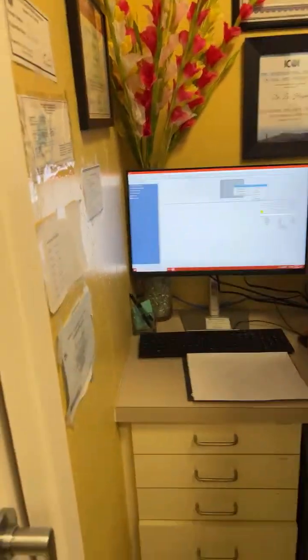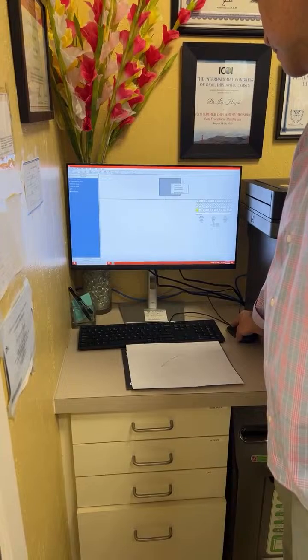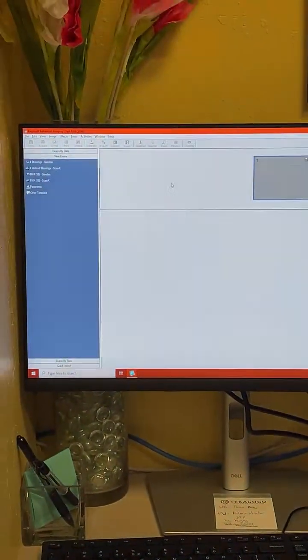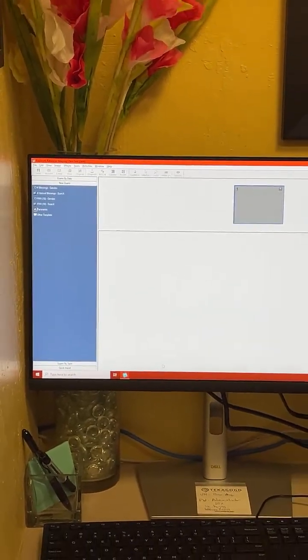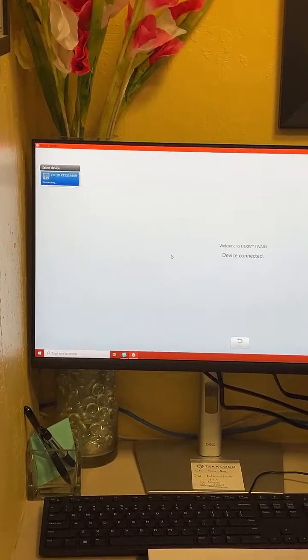It might be default. I'm not sure. Hit acquire so we come out. Well, you have to acquire first. Let me see, we loaded before. There it is. It's loaded.